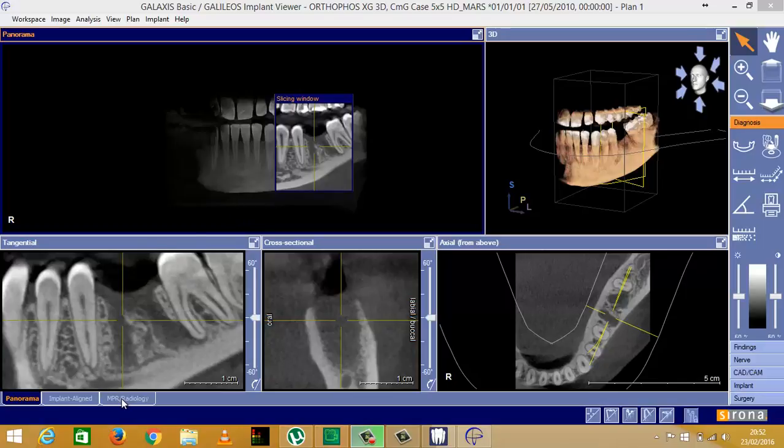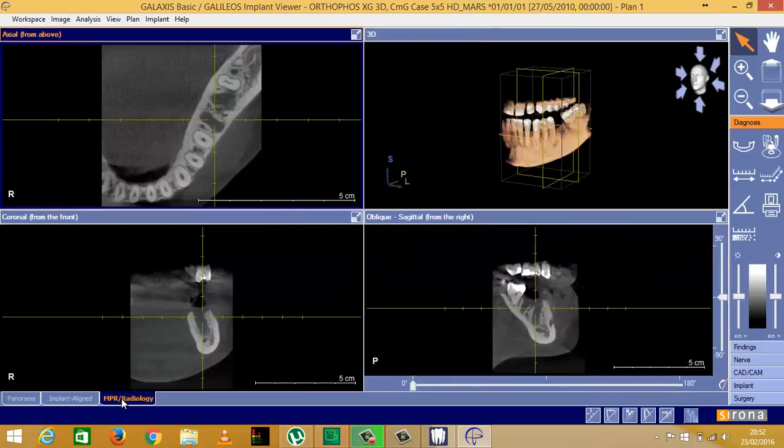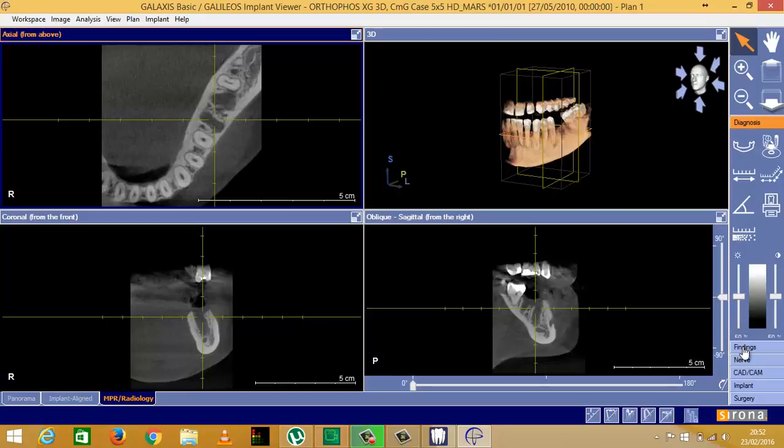Galileus implant, click on this tab here, then go over to the right side of the screen and click on findings.